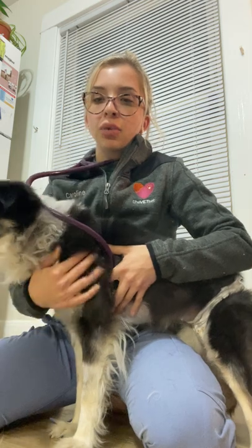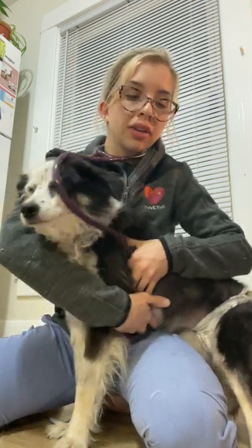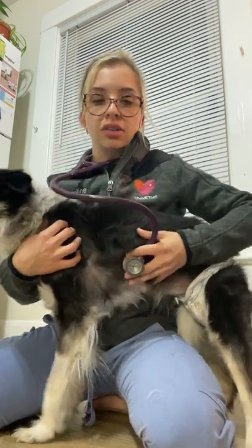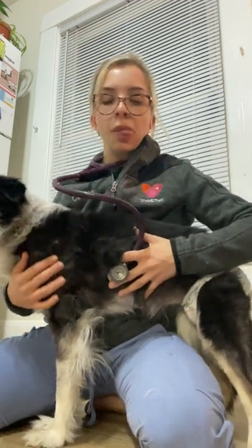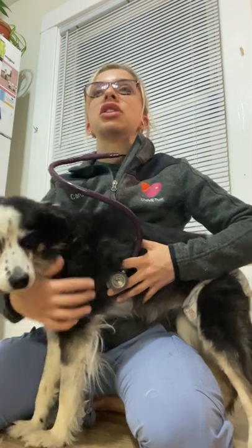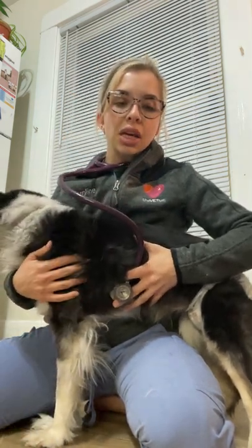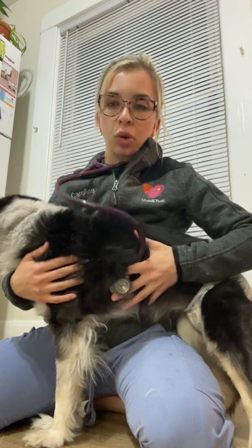Then we're going to go ahead and move caudal to the aortic valve, and just caudal to the aortic valve at the fifth intercostal space we can find the mitral valve. Here we're going to listen for ten to twenty seconds for our cardiac sounds and listen out for anything abnormal.